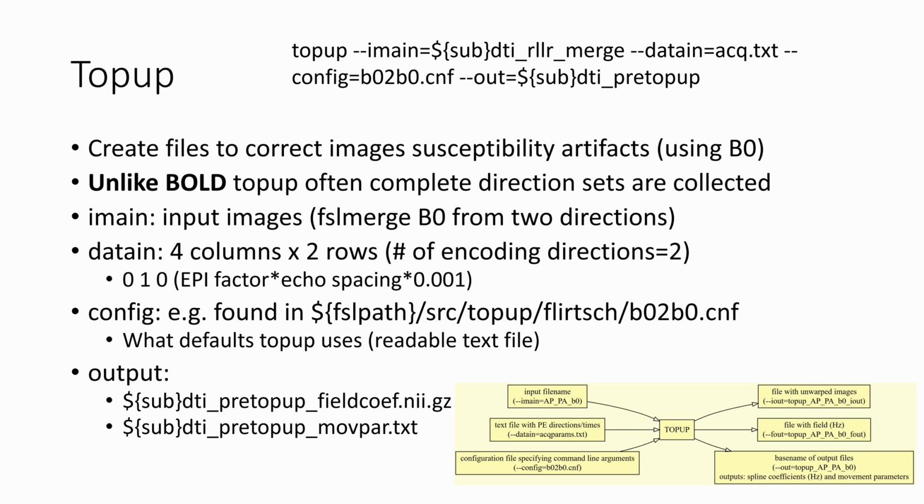Okay, cool. I didn't put in quiz questions this time because it's mostly sort of pragmatics, but some things to think about there is how you want to maximize your ability to measure the directional gradients with the higher B values to get more precision where that precision is available, and not necessarily in those lower B values. So sometimes you'll see people who map those B values out evenly across. It's doable, but you may not want to go that way.